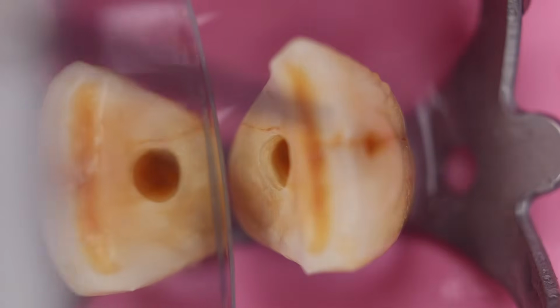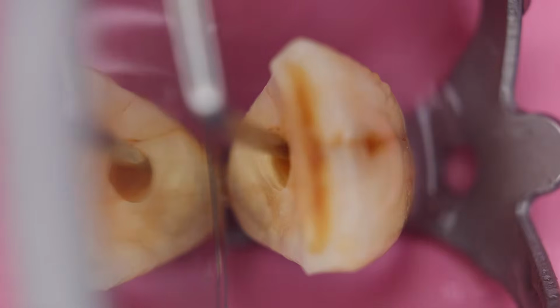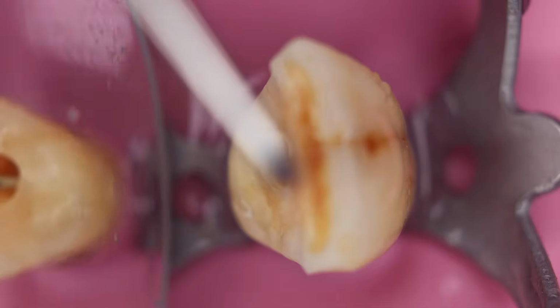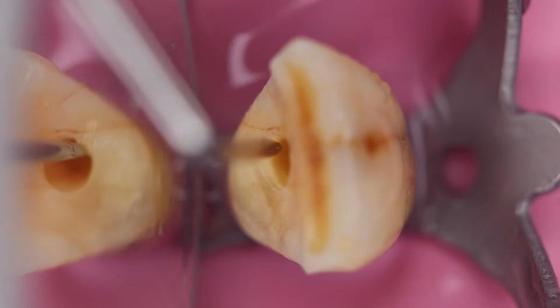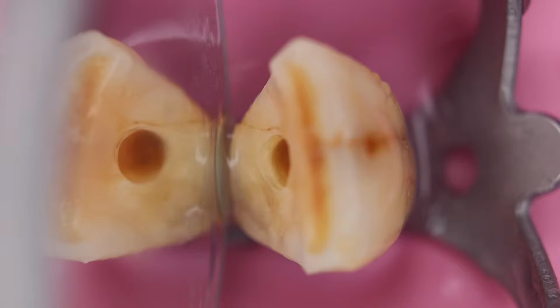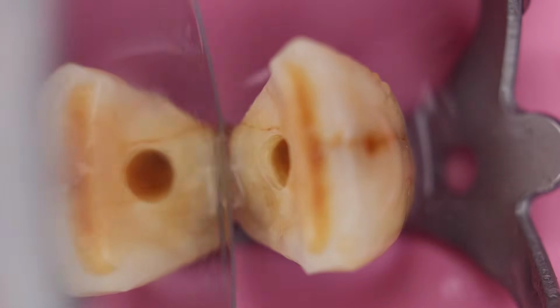Hope you can see that darker area. So angulating the burr in the long axis of the tooth.